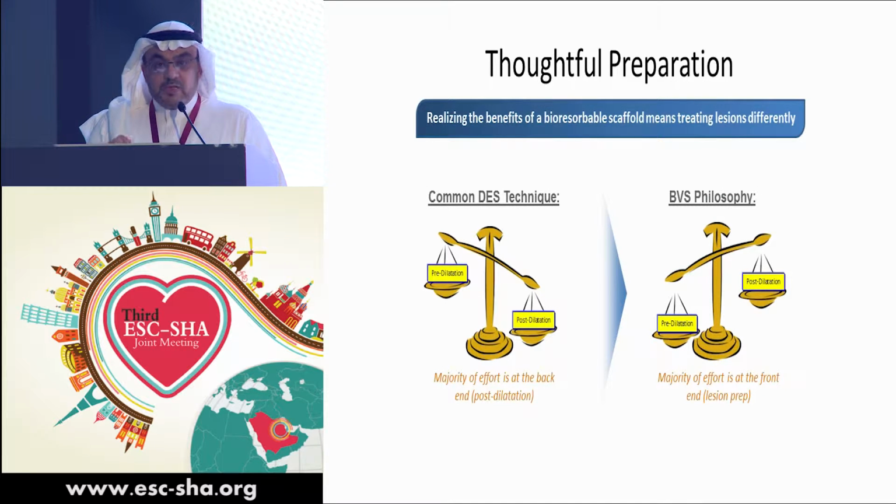The second important message, if you're going to use BVS, is to pay attention to the pre-dilatation. Compared to the DES, the drug-eluting stent, where we now emphasize the post-dilatation as more important than the pre-dilatation, for the BVS the pre-dilatation is most important.